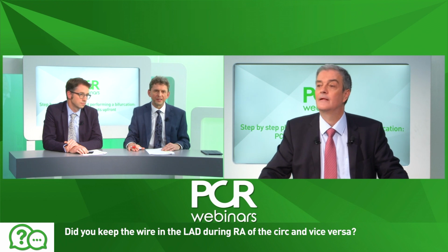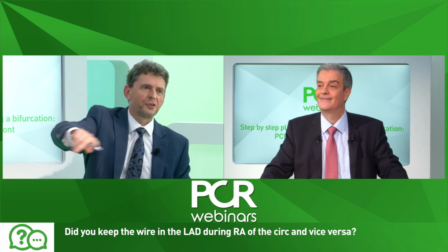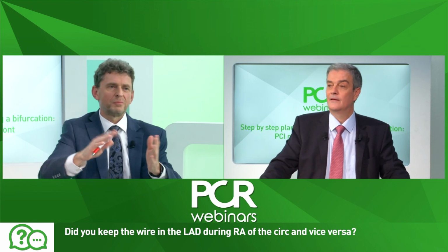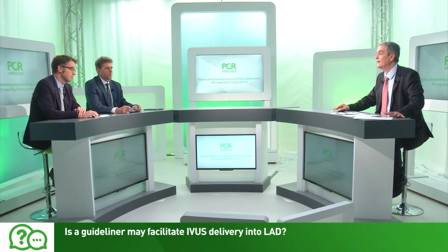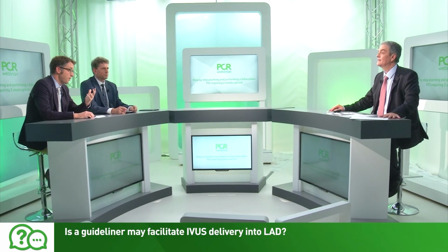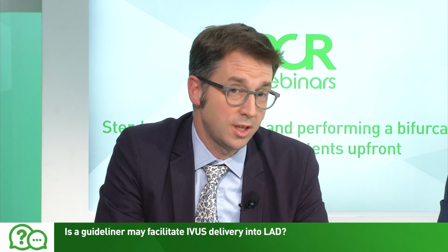You can do this only if wires are not touching and one is in the LAD, and you do the distal circ. There's never. But you know, with 8 French, if you use a guide liner, you can do rota through the guide liner as an option. There is an article in EuroIntervention. And when we are discussing guide liner, may a guide liner facilitate IVUS delivery into the LAD before that dilatation? So in fact, we haven't talked about the guide catheter, and you may see that that's actually a Judkins guide.